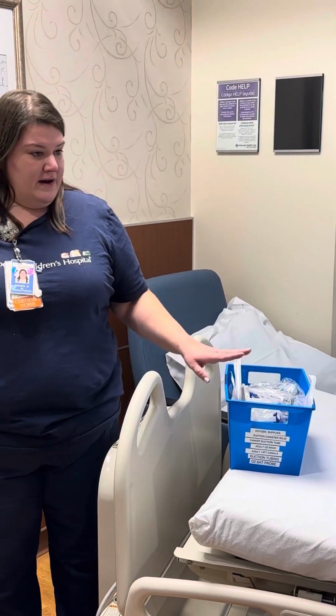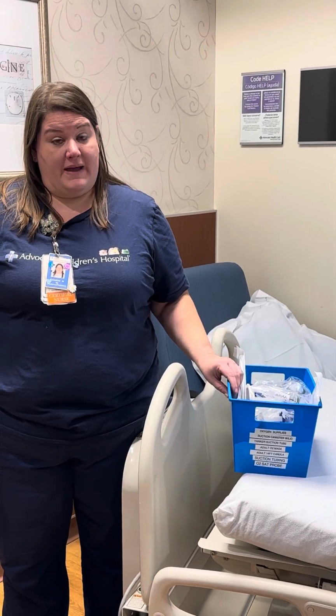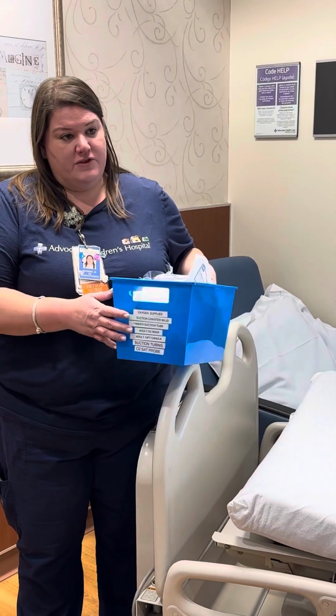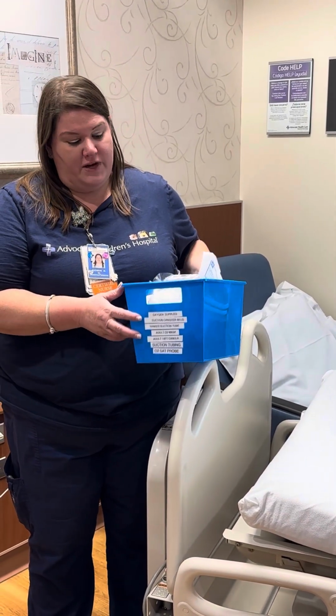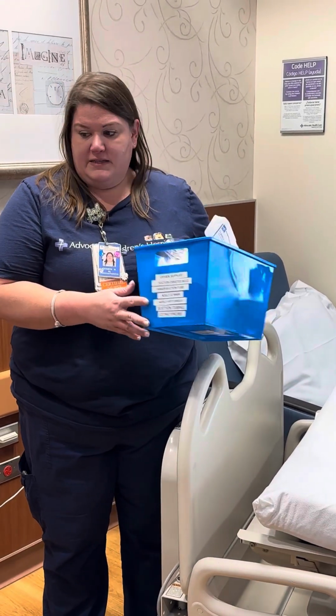So this is how to set up the emergency equipment for any high-risk patient, but especially your MAG patients. So this blue bucket should be in your nurse server on the top shelf. It has all your oxygen and suction supplies in it. So we're gonna take this and set up the room.